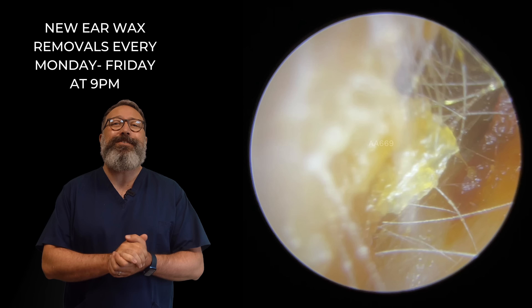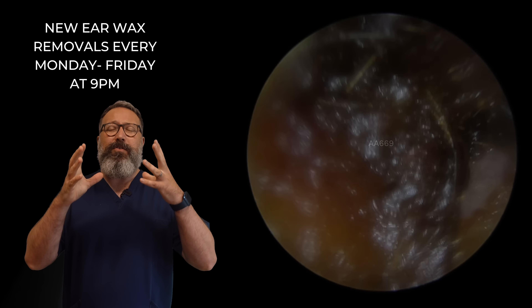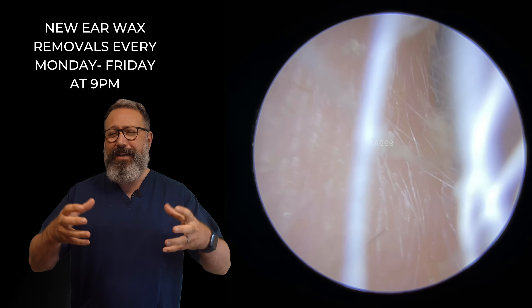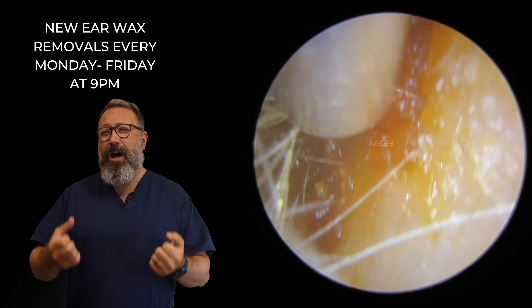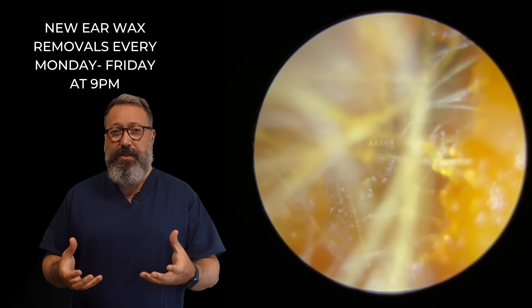Hi everybody, this is Rhys Barber from Audiology Associates. Thanks very much for watching the wax removal video today. We've got some really dry wax in this particular patient's ear canal. This patient tends to produce a very, very dry type wax. It tends to harden really quickly. It's a very dark type wax as well that comes out of this particular patient's ear canal.